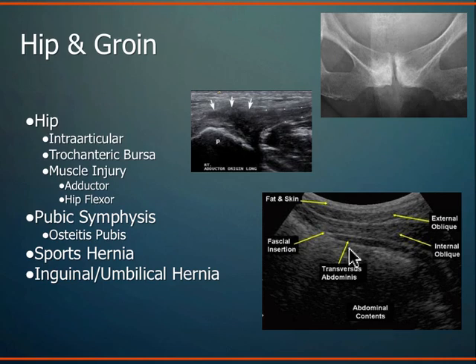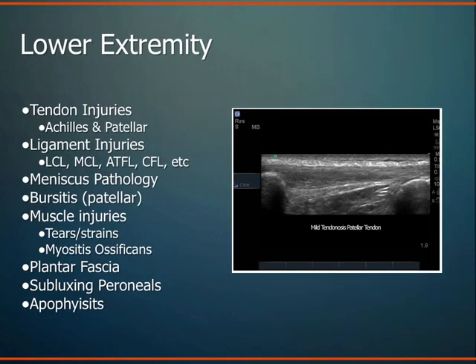Another very common source of pain in the groin, particularly in athletes, is osteitis pubis, or just chronic changes at the pubic symphysis, inflammation. The best way to work through your differential on that is to inject it. It's obviously a sensitive area, so you want to have image guidance to inject. You can see it quite well on ultrasound and use ultrasound guidance for those injections.